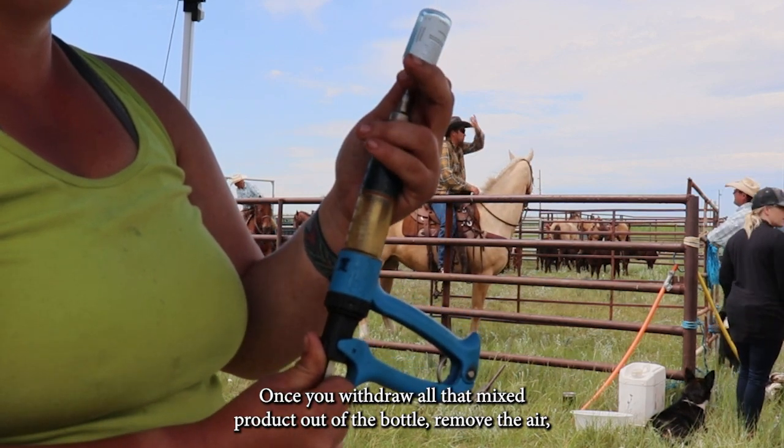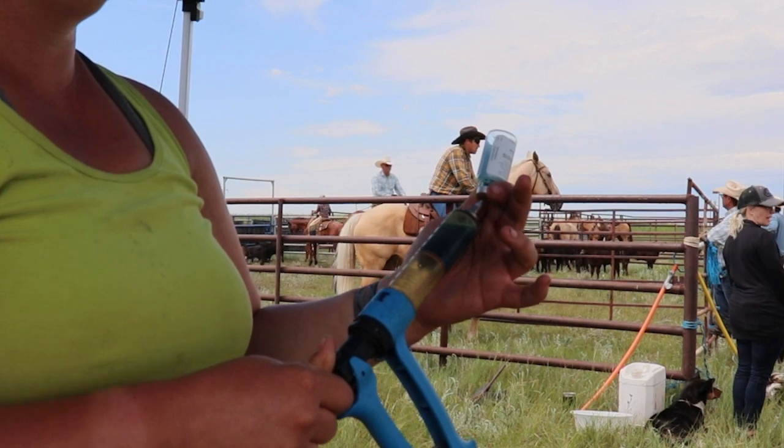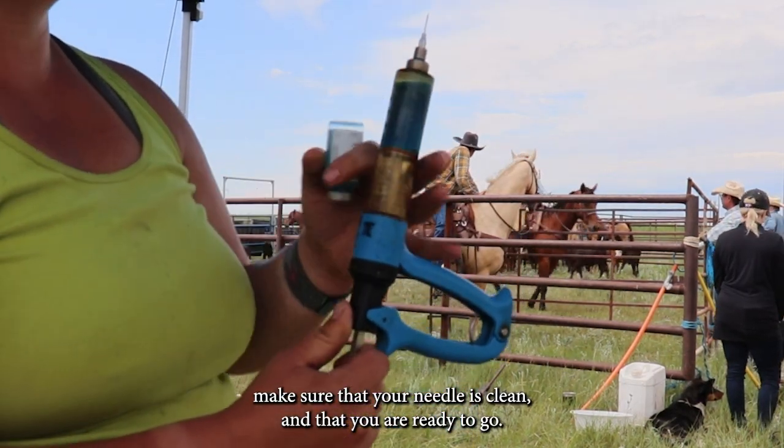Once you've withdrawn all the mixed product out of the bottle, remove the air. Make sure that your needle is clean and that you are ready to go.